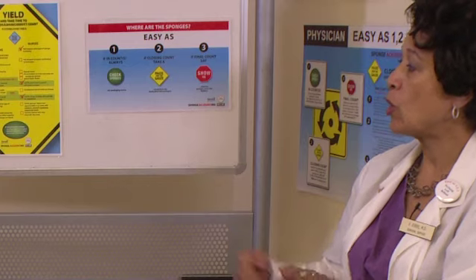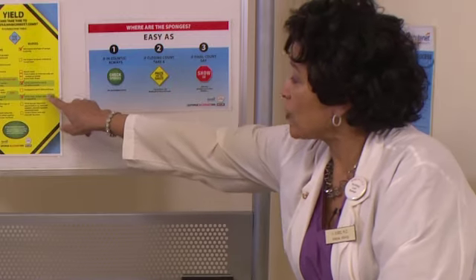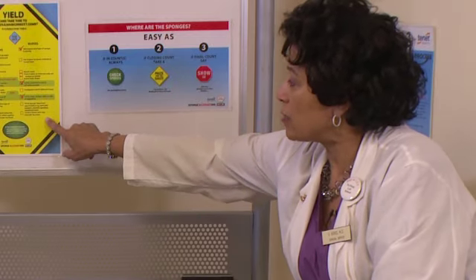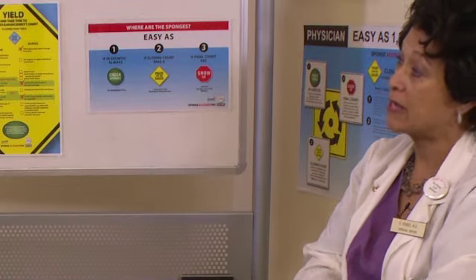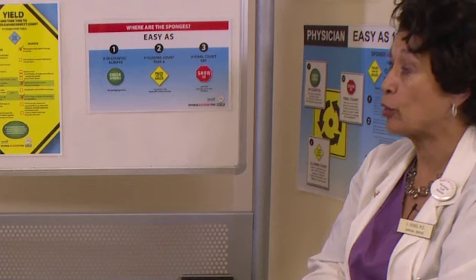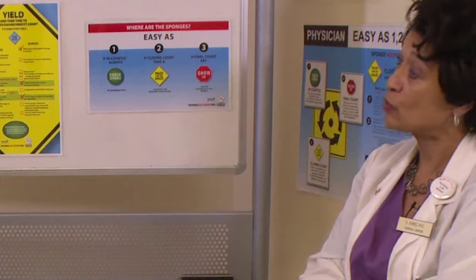Sure. So in the incorrect count checklist, what we point out is that if you have failed in the OR or in the procedure room to identify the sponge, now you need to bring in that other stakeholder, which, as you mentioned, is our critical defender, our radiology colleagues. And that includes our radiology technologists as well as the radiologist who may be sitting someplace else looking at the now very common digital images.